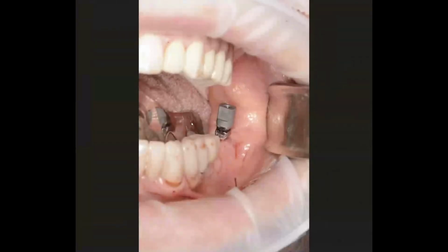We meet some folks out west from Fresno, California, who have a long screw that they want you to screw into the alveolar ridge. Let me go back to this picture that I'm sharing here, because I can demonstrate there if you can see my cursor. Look at this image. They want you to put in that one fiducial. Maybe you put it in 17, maybe you put it in 31. Maybe you just decoronate, you cut off the crown of your first bicuspid or your canine. I think they typically recommended your canine. They would cut off the canine and just sink this into the root.